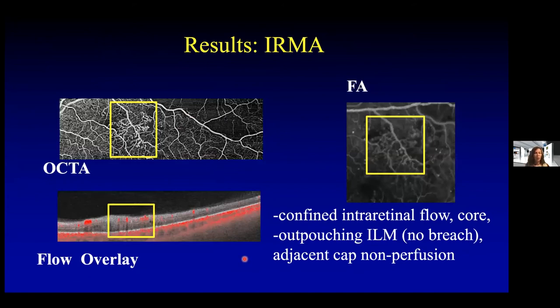Here's a case where on the OCT-A there's a foci of abnormal blood vessels. On the flow overlay, we confirmed that this flow is confined to an intraretinal location — while there might be a little bit of outpouching of the ILM, there is no extension or breach through the ILM. This is consistent with IRMA, and fluorescein angiography on the right, which was our ground truth, confirmed this was IRMA.